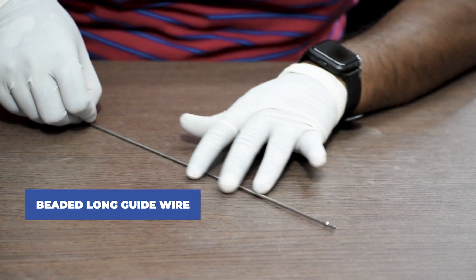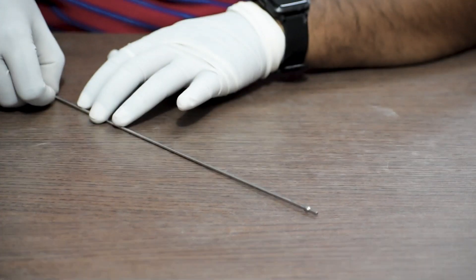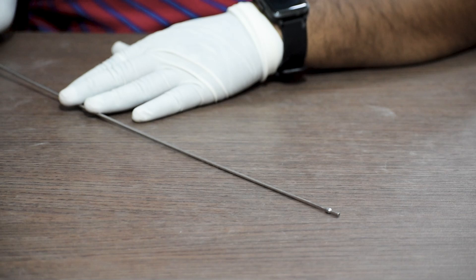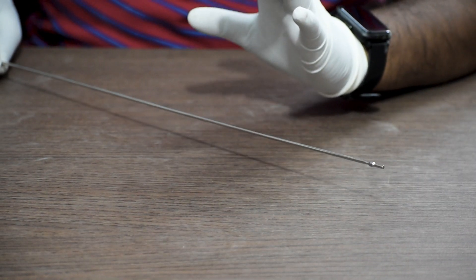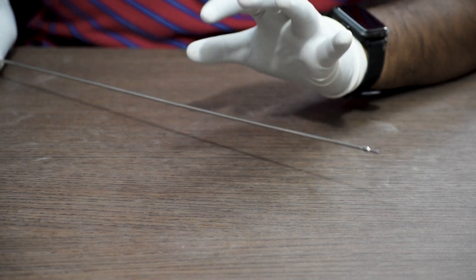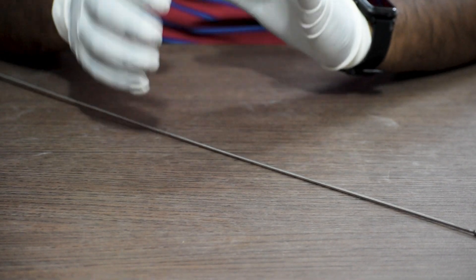Once the entry point is created, you will have to insert the beaded guide wire or the olive guide wire through the entry point. This guide wire helps in doing reduction and also guides all the instruments and implants — like the nail, the reamer, and all other instruments — in proper alignment.